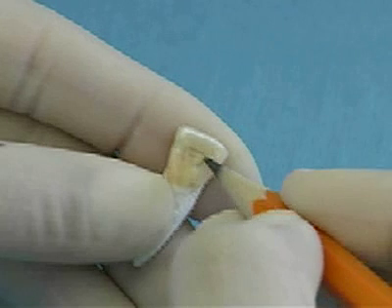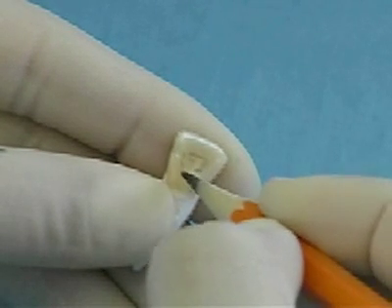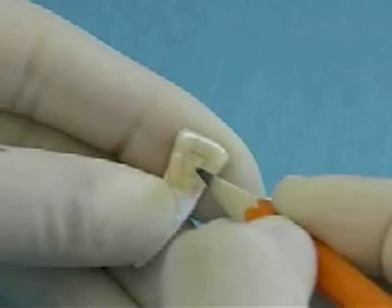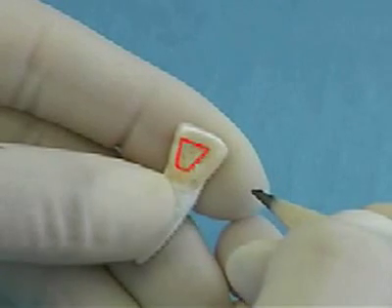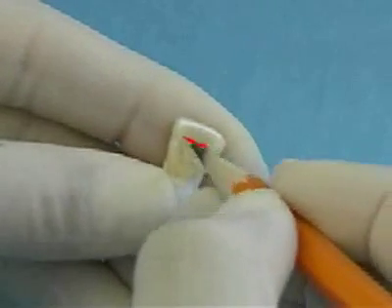For your first time, outline the coronal axis on the tooth in pencil, using the coronal preparation slides as a guide. The axis outline for a maxillary canine is similar to an upside-down triangle shape with the base of the triangle parallel to the incisal edge.